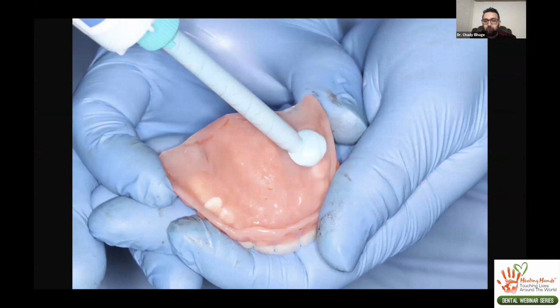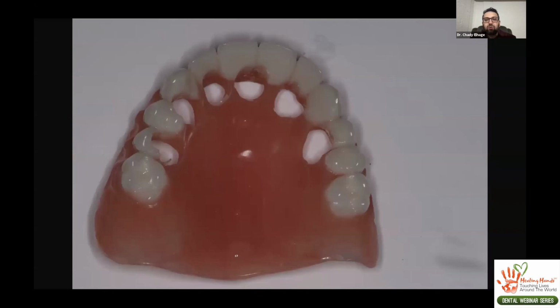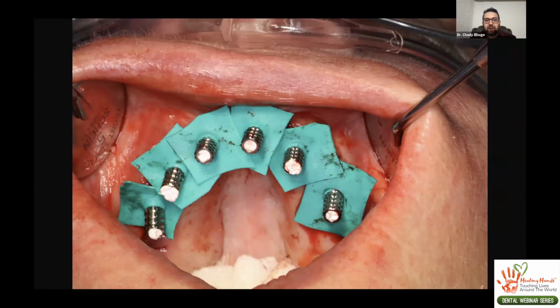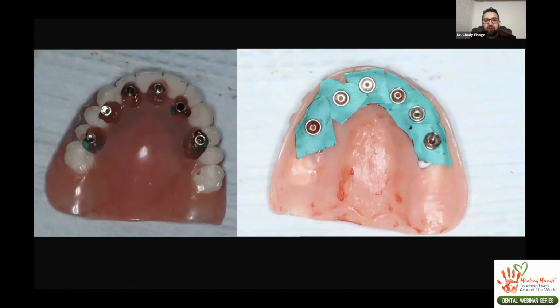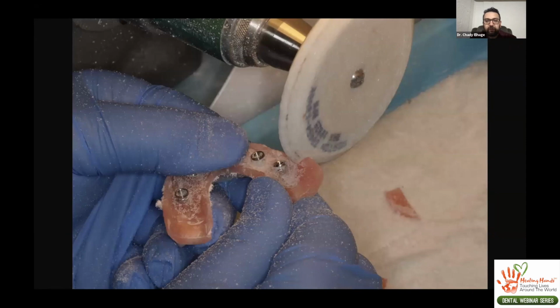We come in with our denture. We pick it up. We drill the holes. We get an impression. Holes are drilled in the denture. These are what will connect to the denture. It's fit in place. We inject material in there. And then this all gets unscrewed. We have a model made at time of surgery. And then we cut the whole denture down. This is what our new prosthesis will look like.